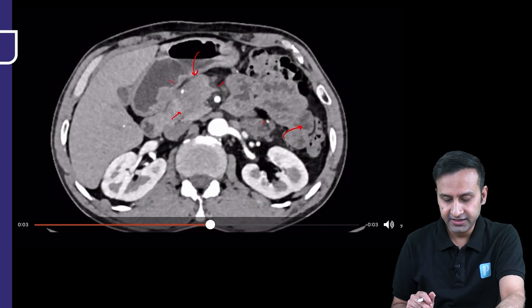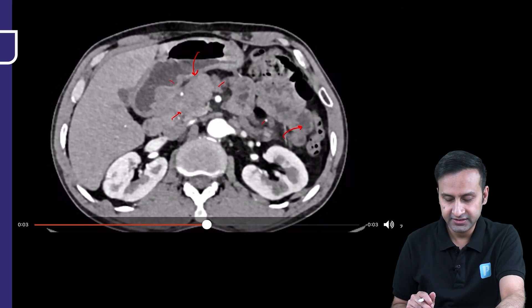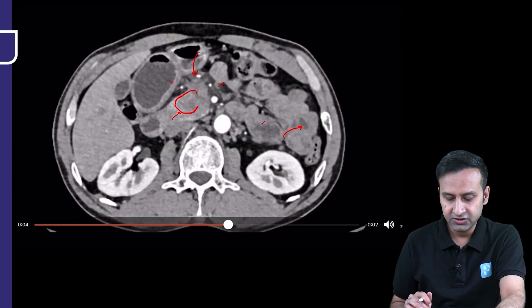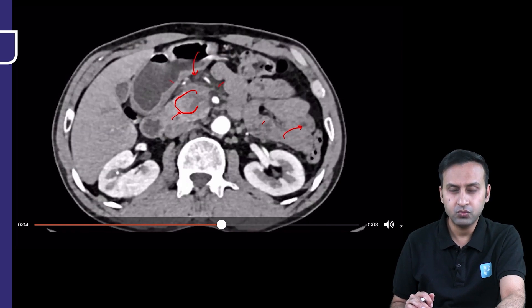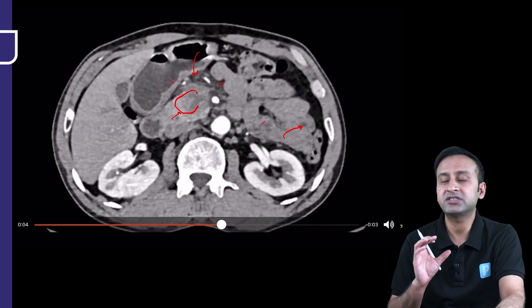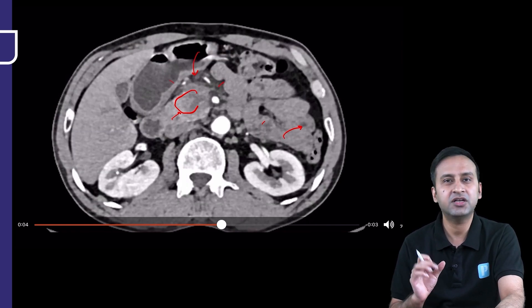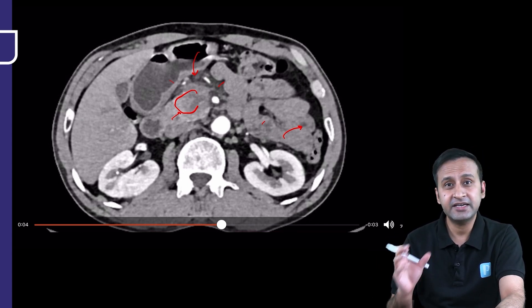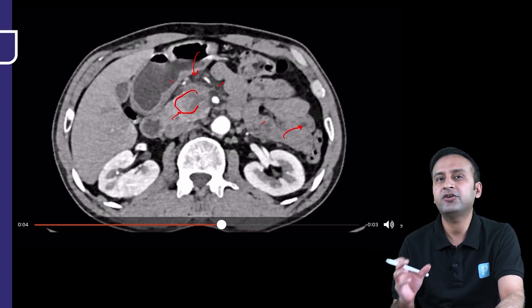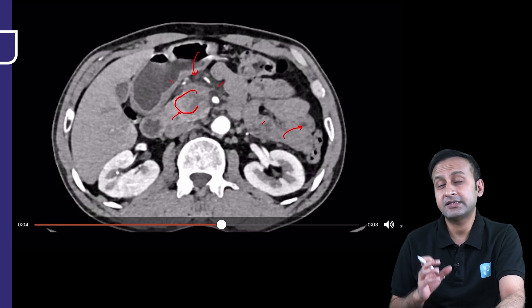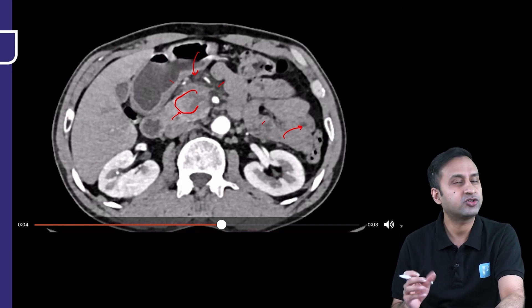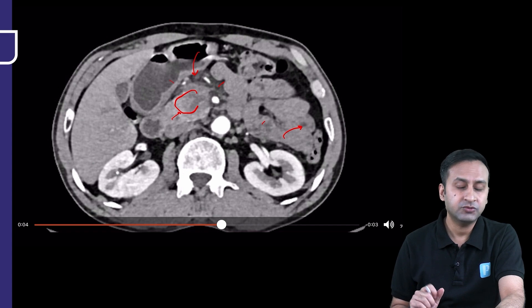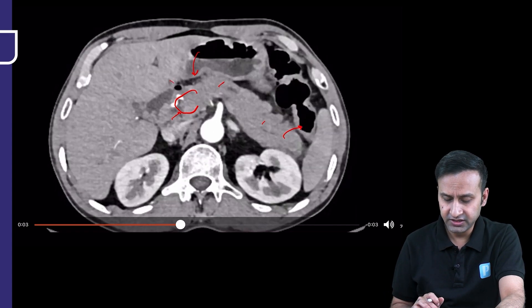The main pancreatic duct is dilated, dilated, dilated — but exactly where the lesion starts, the main pancreatic duct is not well seen. Whatever we're dealing with involves the pancreatic head and uncinate process: it enhances less than the rest of the parenchyma, and it is causing obstruction to the outflow of pancreatic contents through the MPD. That was the arterial phase; everything else looks quite normal.